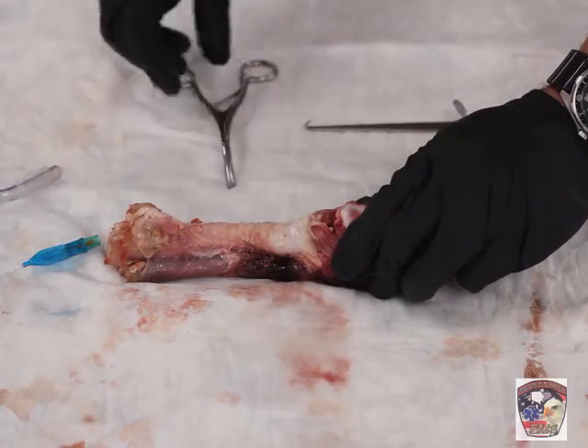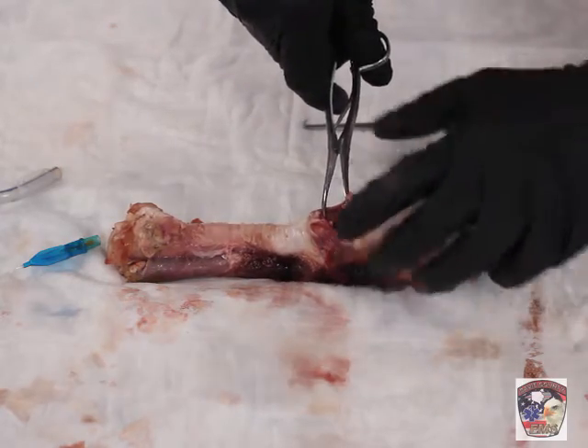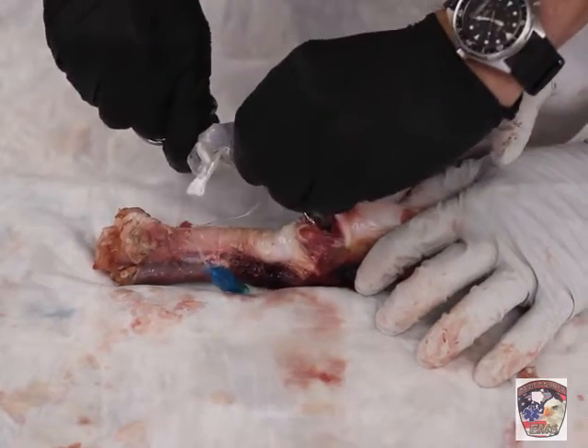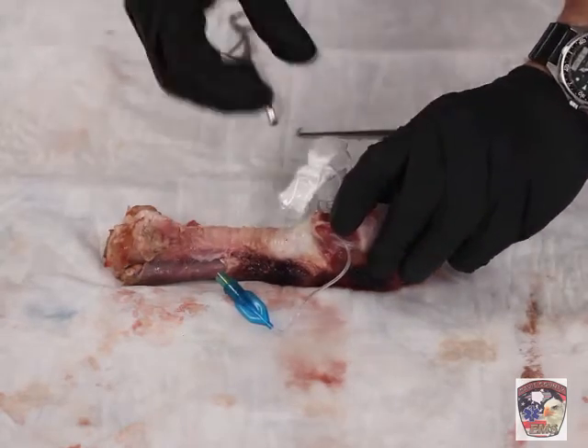You can also use the trousseau dilator. I will dilate the trachea, put the airway in, and then I'll rotate and put the airway in.